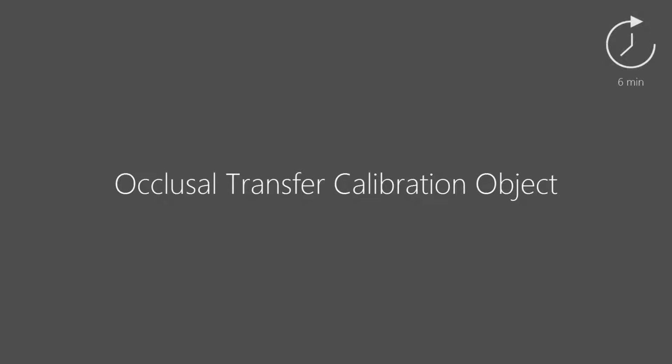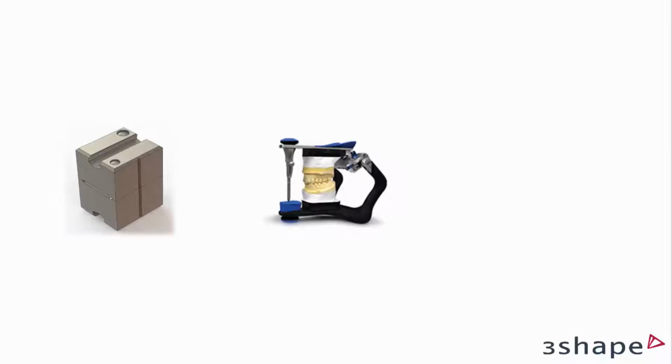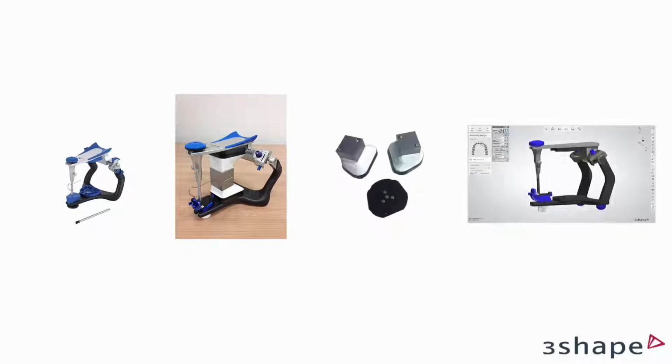In this video, you will learn how to use the Occlusal transfer calibration object. The Occlusal transfer calibration object is used for calibrating the position of mounted models from a physical articulator to a virtual articulator. You can calibrate your physical articulator with its virtual version by mounting the calibration object in gypsum in the articulator and transferring the object position to transfer plates and then the software.